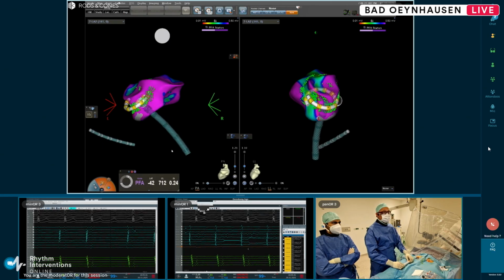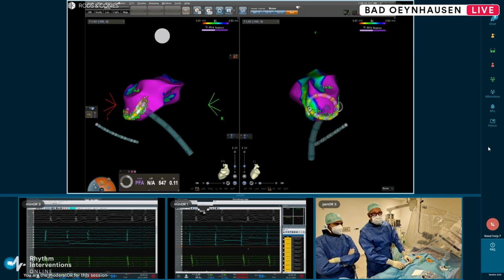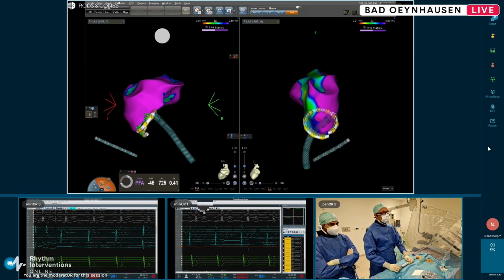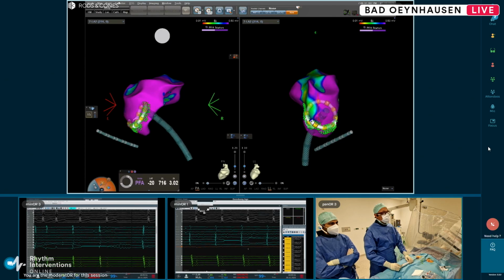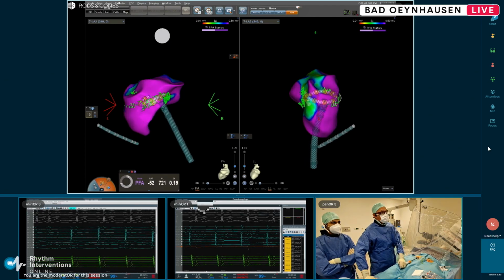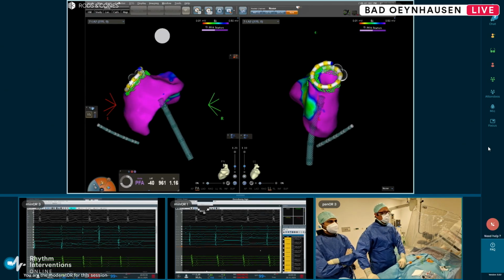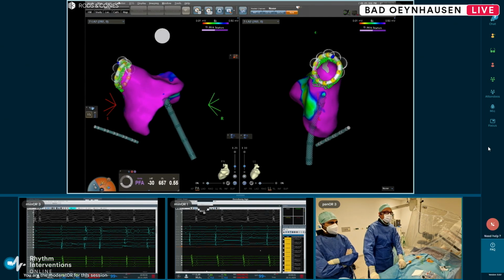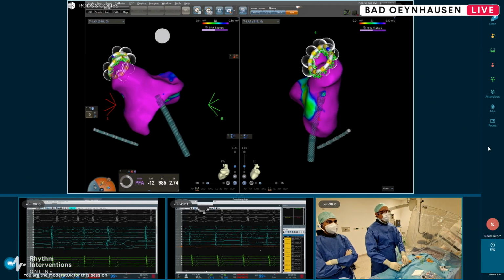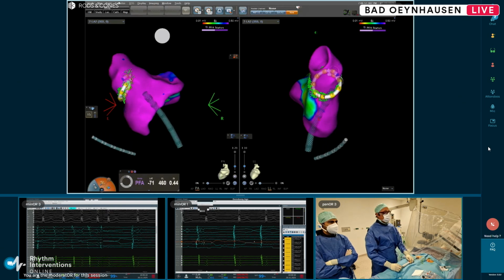You can also see when we have a look at the electrograms just for a second how good the quality is in terms of giving us information about the myocardial amplitudes, and you can see that then we can advance the catheter towards the veins, which is always important, taken into consideration the catheter design. Here is now the left superior vein. You can see some delayed signals here already. So this is one of the veins, and we know the patient has 4 separate veins.